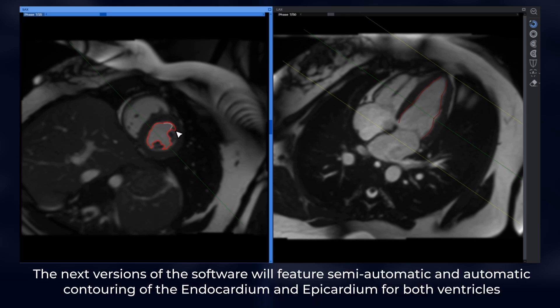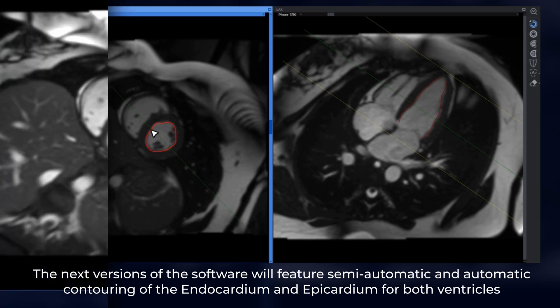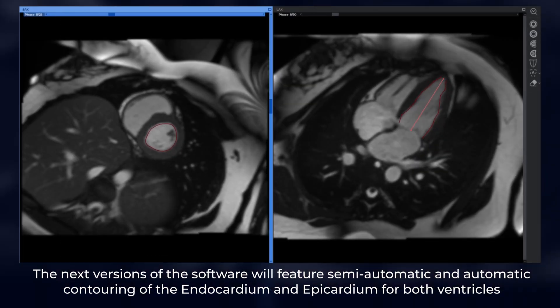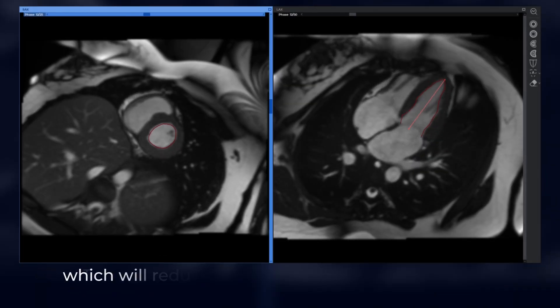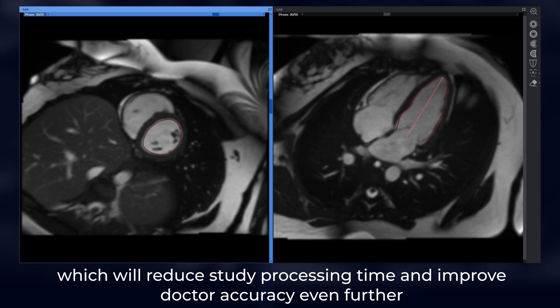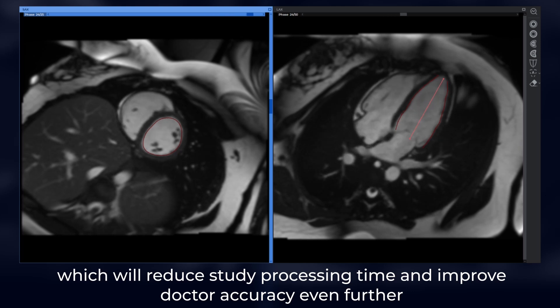The next versions of the software will feature semi-automatic and automatic contouring of the endocardium and epicardium for both ventricles, which will reduce study processing time and improve doctor accuracy even further.